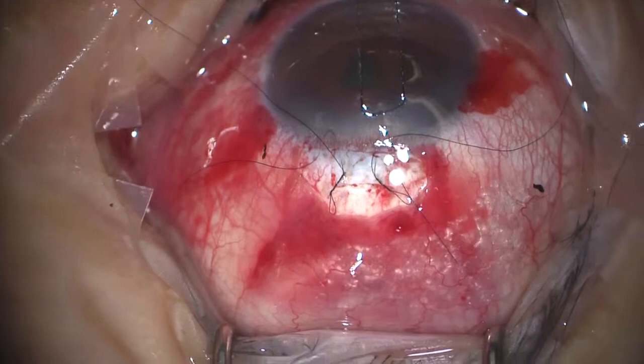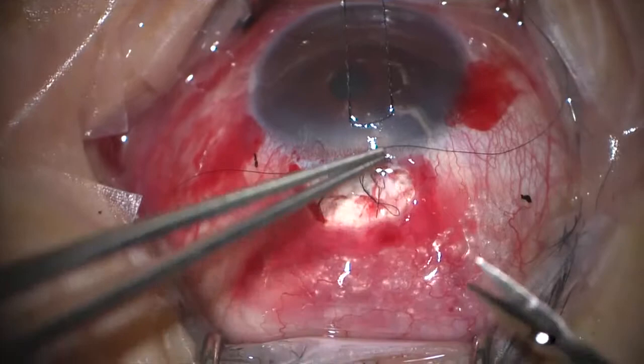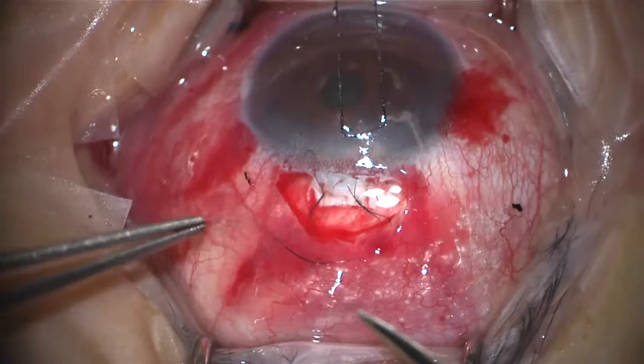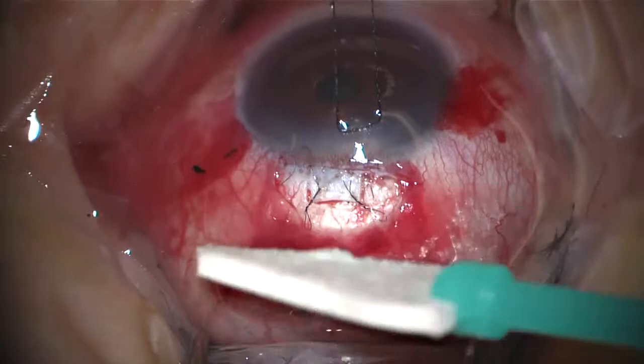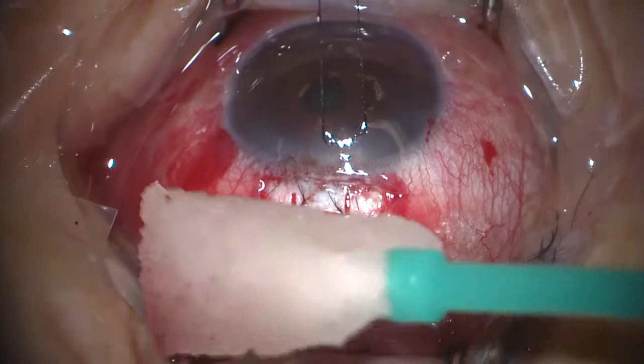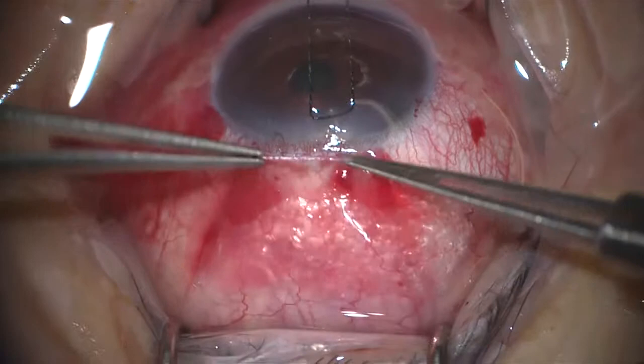So just to make the point that for a routine trabeculectomy, we use just as a routine two releasable sutures. If you've got high risk cases, and what I mean by high risk is young patients, high myopes, normal tension glaucoma, as a routine, we use three releasable sutures at least. And that's because even if there doesn't seem to be any drainage on the table, a week later, they tend to suddenly overdrain and become hypotonous. So leaving three releasables is much safer.